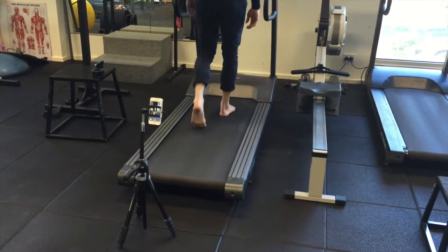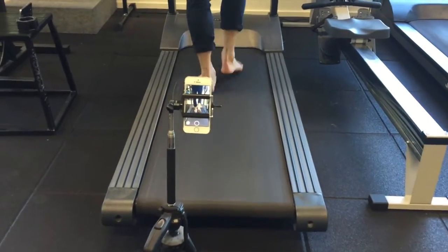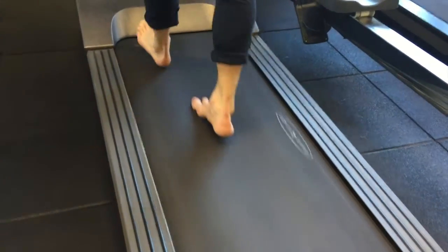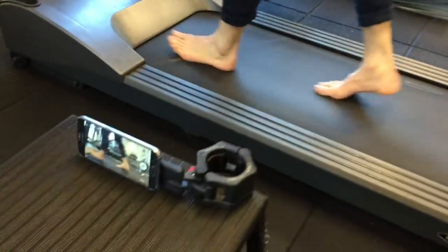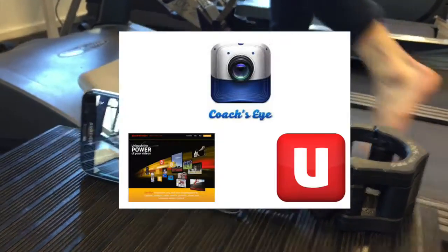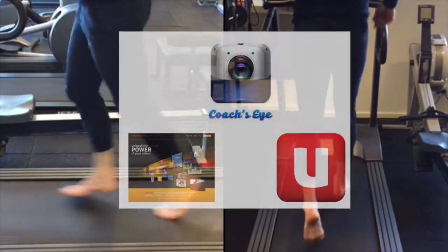The first is video gait analysis with the assistance of an app on a tablet or a smartphone. Now, this is perhaps one of the most popular methods for assisting clinical gait analysis. Video is collected from at least two cameras, one from the sagittal plane, the other from the frontal plane. The video footage can then be analysed on tablet or smartphone using one of many apps. The popular ones include Coach's Eye, Dartfish, and UberSense.